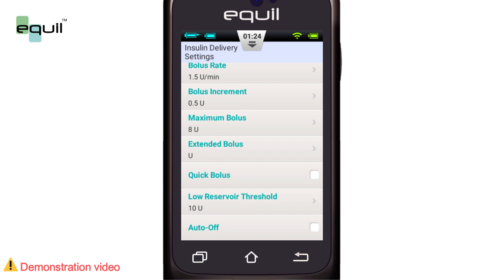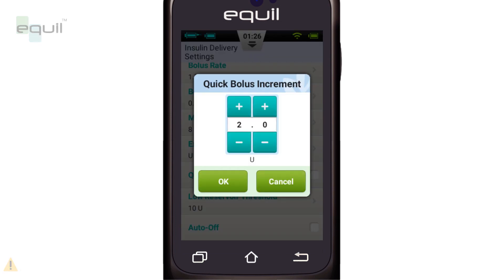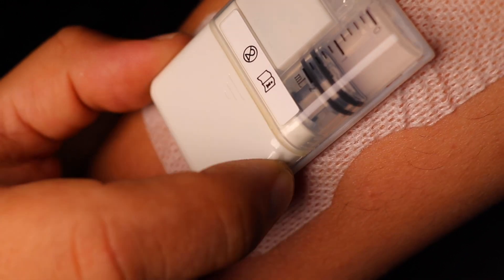The last thing is to set the Quick Bolus settings, which will be discussed later. It is inactive by default. Click the check box next to the quick bolus to enable it. The Quick Bolus Increment sets the amount that the bolus increases with every quick bolus button pressed.